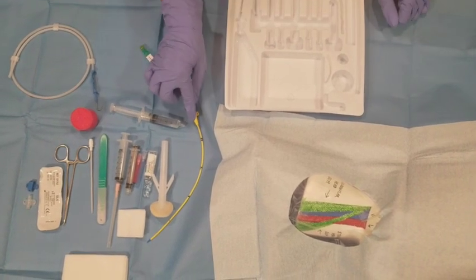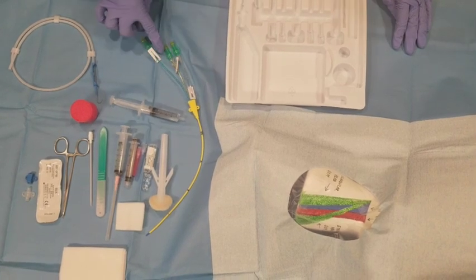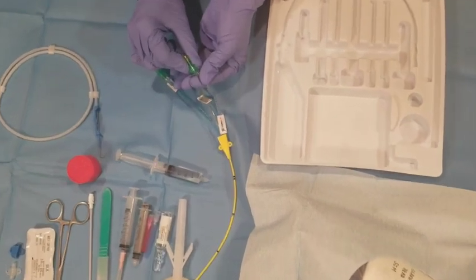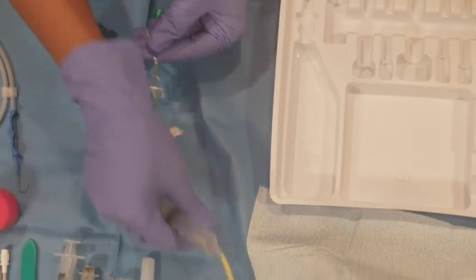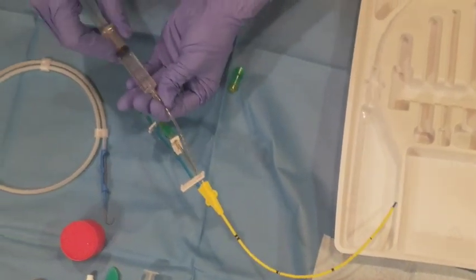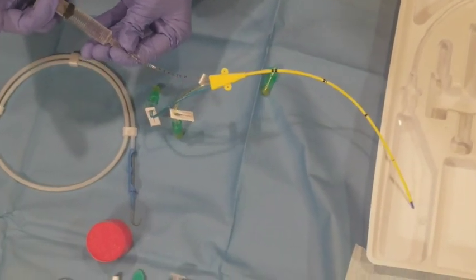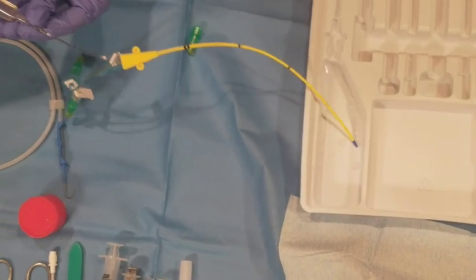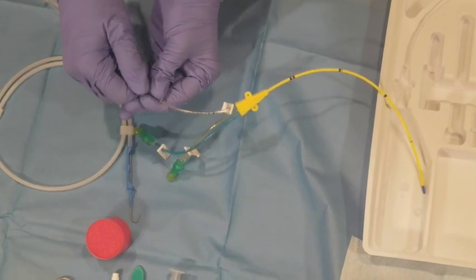Okay, so first we want to make sure our triple lumen catheter, which is this piece here, is working. We want to make sure each line is cleaned. So first, we want to take off each cap and make sure, I put this tray here to see whether there is a free flow of liquid. And as you can see in the tray, you can see the water flowing through the catheter, which means this line is clean. We want to close it after we're done testing it.